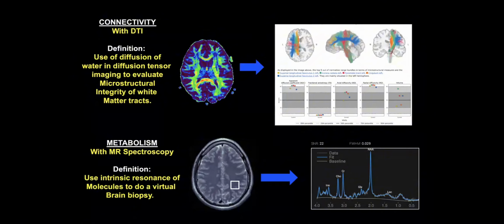But we can do more than assess brain structure and blood flow. Blood flow, again, is really important because it can be abnormal even before you see brain atrophy. But the most vulnerable and most frequent area of damage in traumatic brain injury is the white matter. And so we can assess white matter connectivity with diffusion tensor imaging. We can look at the microstructure of the white matter. All of these red and yellow and green areas are the white matter of the brain connecting the gray matter. The gray matter is dark because that's not the area being highlighted.